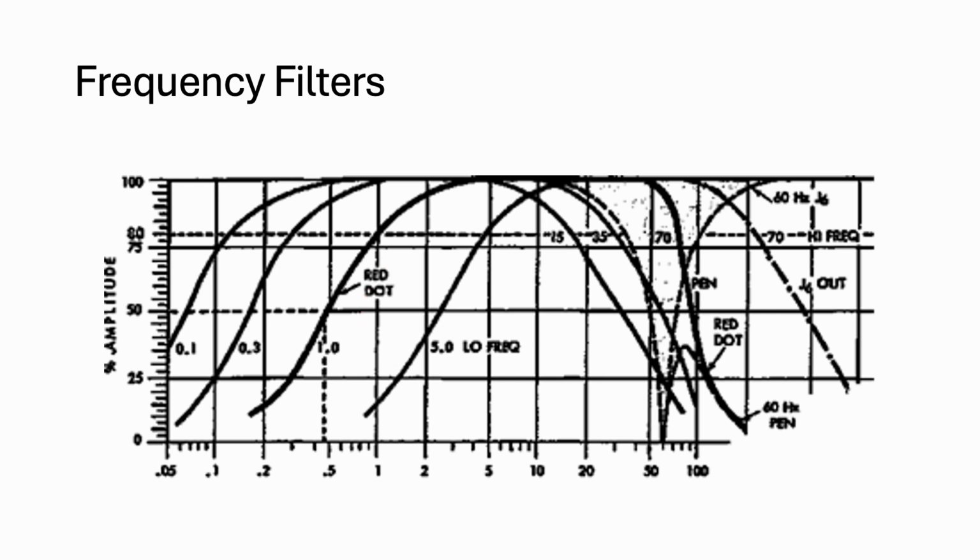You do not see these in sleep studies. Okay? So understand that this is just a graph that is demonstrating or explaining how low and high frequency filters cut off certain frequencies. That's all.